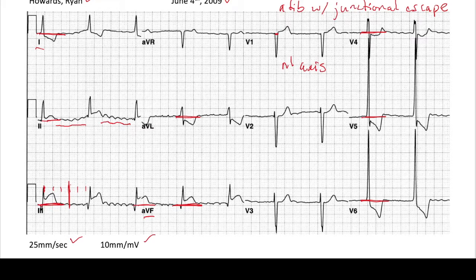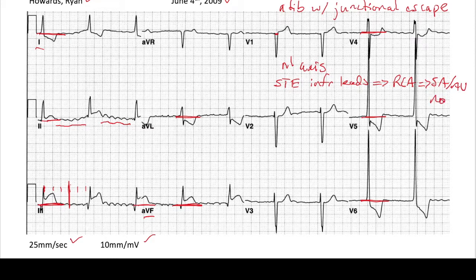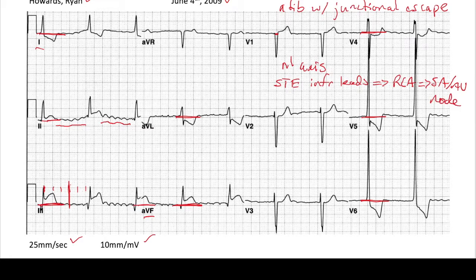So this patient has slow AFib with junctional escape and ST elevations in leads 2, 3, and AVF — the inferior leads. Remember, the inferior leads correspond to the RCA territory. The RCA supplies the SA node and the AV node. So it's very possible this patient developed atrial fibrillation with junctional escape because they have ischemia to the RCA affecting those nodes. If this patient just developed AFib, it's likely due to the inferior STEMI they're having.